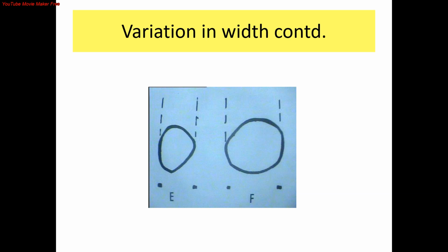Here in figure E, it is showing a cross-section of a canine where the left-hand line is long and straight, producing a dense white and narrow shadow, whereas the opposite right-side border is convex and the rays only pass through the summit, producing a shadow with poor definition. In F, a transverse section of lamina dura of a molar shows that mesial and distal borders are curved and unequal, so neither shadow is sharp due to curvature of dense bone.